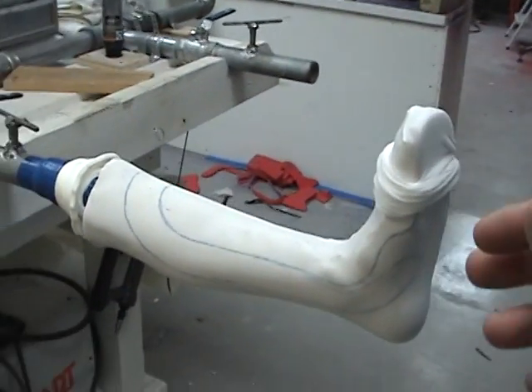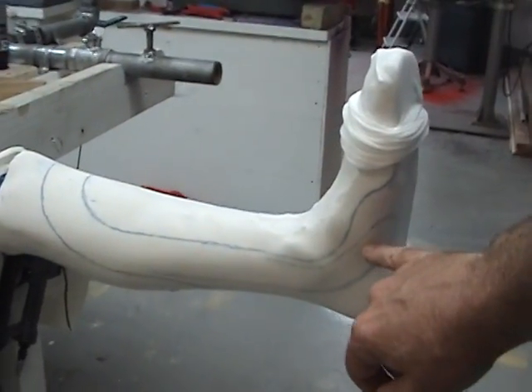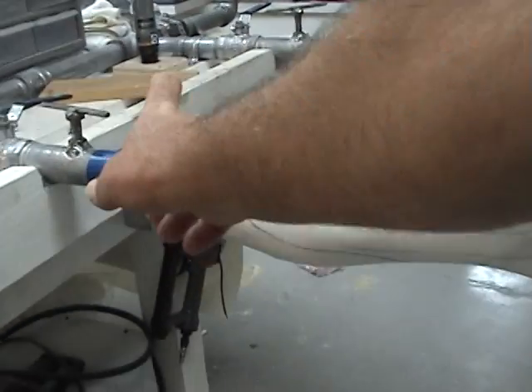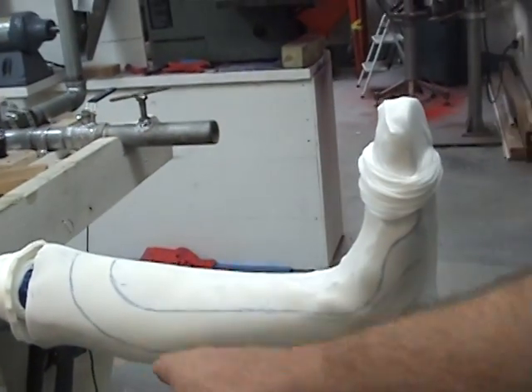This is our model. It's ready for plastic. The plastic is cooking. You can see the marks on there. Here we have where our strut is going to run. We've applied Super 77 spray so that the plastic will stick.